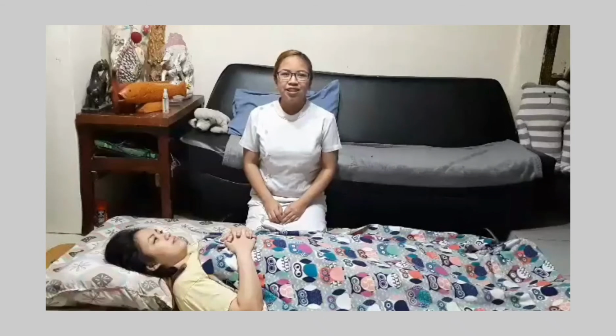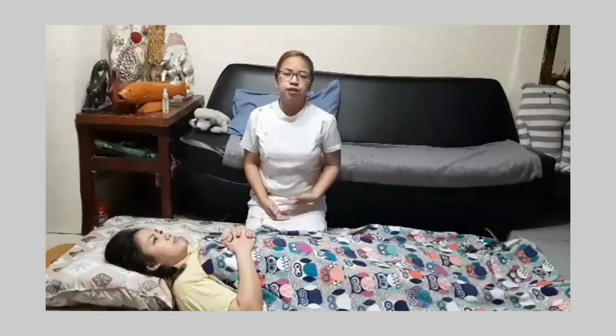Hi, I'm Daniel Hershey Espelita, and today I'm going to perform the fundal height measurement, Leopold's maneuver, and the fetal heart rate. Starting off with the fundal height measurement, it is used to determine if the height of the fetus is appropriate for the age of gestation.